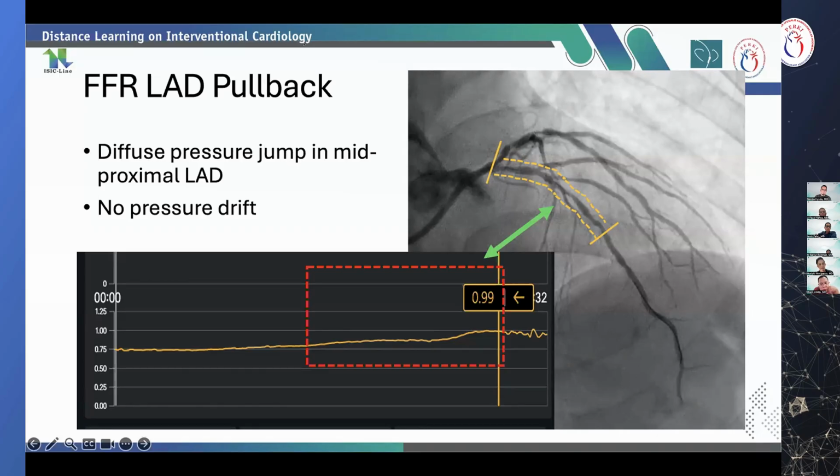But for the OCT, maybe there is an ostial problem, slightly fibrocalcified, and if we think about the potential to treat the left main, although the FFR of the LAD is still normal, maybe it will become shifting plaque or compromise to the LCX.